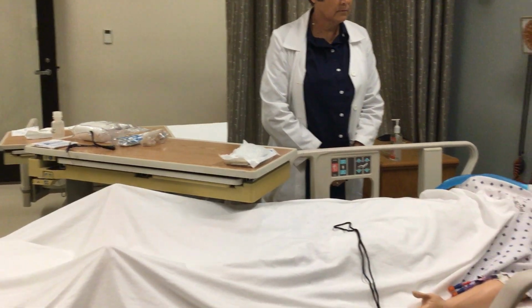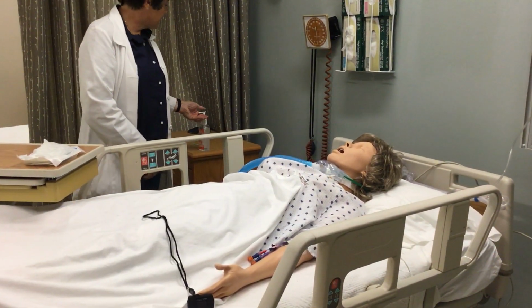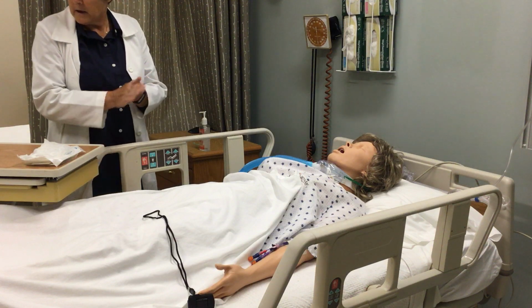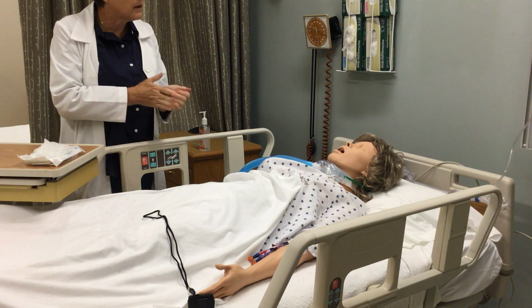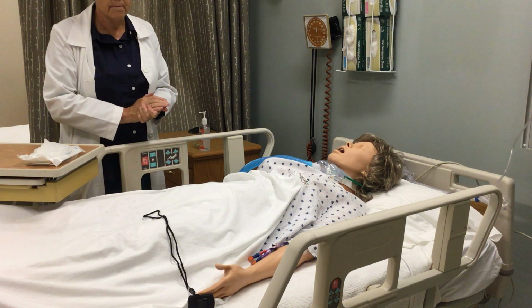Introduce self to the patient and family and perform hand hygiene. Hello, Miss Cruiser. My name is Christy, and I will be your nurse today. I have to suction your trach. I see you have some secretions, and I also have to provide care to the site around your tracheostomy and put a new dressing on.